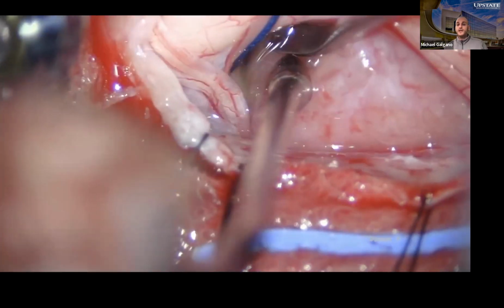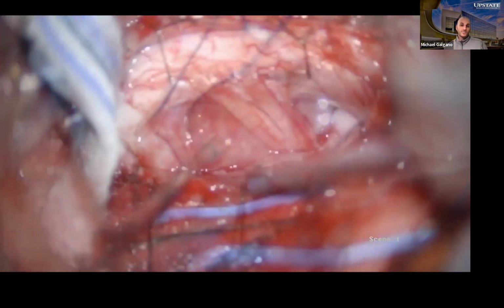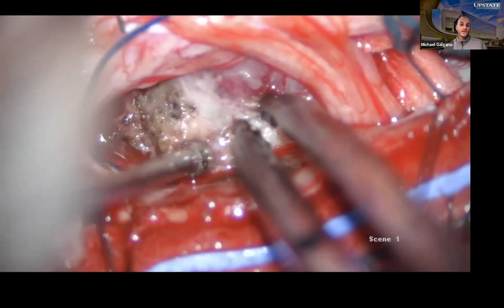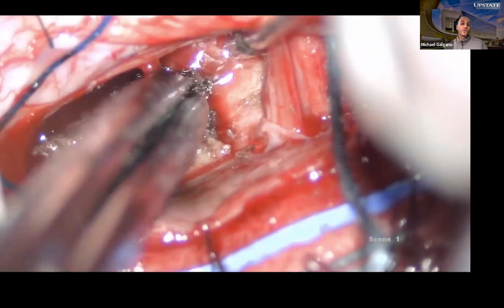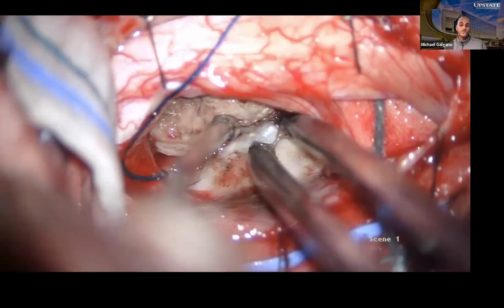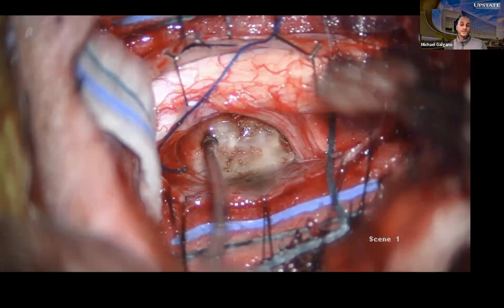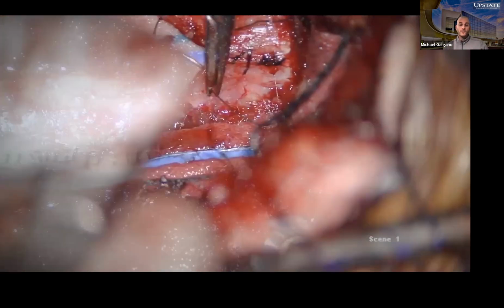When I take these out, I try to take them out en bloc if I can. I hate using ultrasonic aspirators, because I think it starts bleeding and then you could miss tumor. So what I do is I just bipolar these. I cauterize these. It emulsifies and dehydrates the tumor, and it makes it a lot more manageable. It decreases the overall volume of these tumors, in my opinion, probably by about 1/3 or even 2/3 sometimes. You could see we haven't cut into the tumor at all, but it's decreased pretty significantly. Once we had a resection here, you could angle the scope and make sure you don't miss anything.